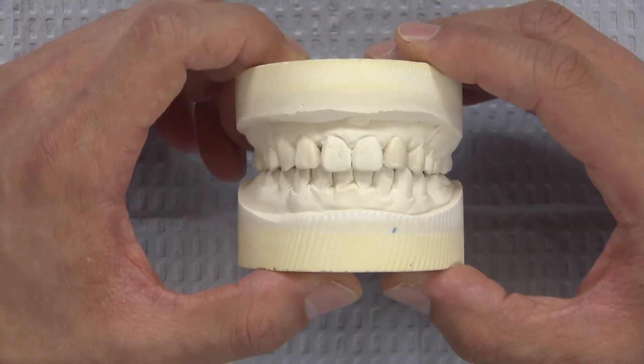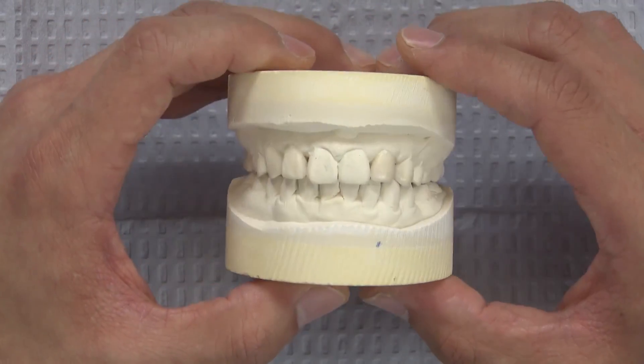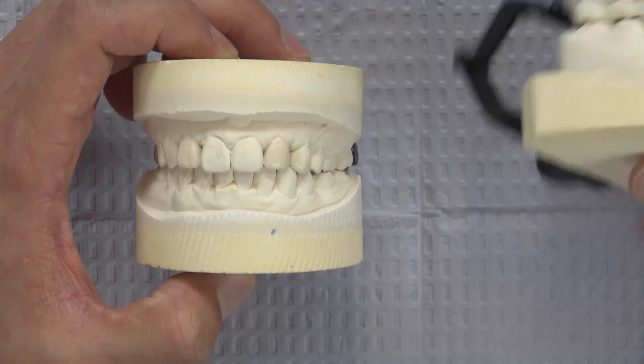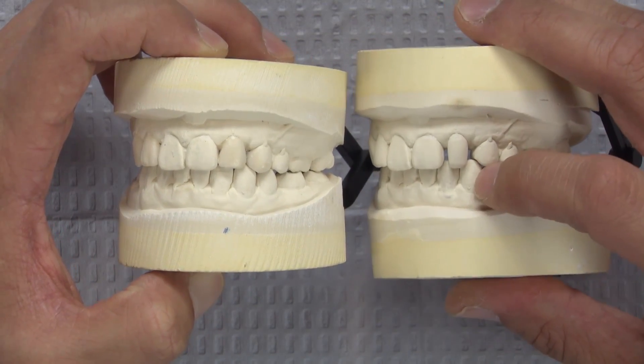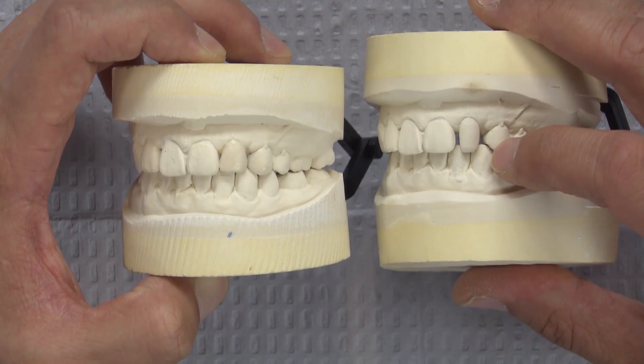To plan out what we're going to do for this case, I went ahead and poured up a separate model and waxed the aesthetic areas up. The first thing I actually did was reduce the length of number 10. The original length is just about even with the central, so we do want to shorten that a little bit for a better aesthetic result.